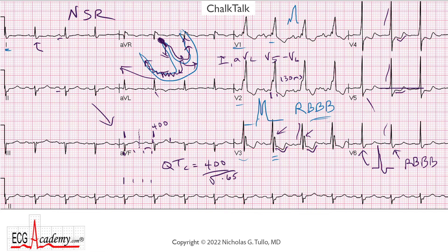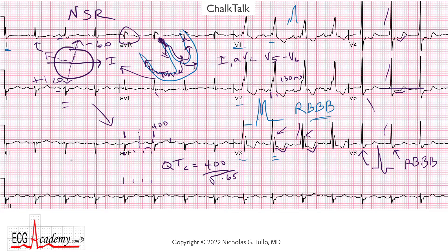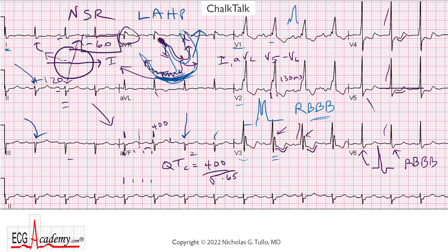Next thing to look at is the axis. Look for which lead is most isoelectric — it looks like it's AVR. AVR should never be isoelectric under normal circumstances because AVR is pointed about 30 degrees above lead 1 headed towards the right arm. That means the axis is either minus 60 or plus 120. If you look at leads 2, 3, and AVF, they're negative — meaning the axis is going away from the feet — so minus 60 is the correct axis. The first thing you want to do is make sure you're not dealing with an old inferior MI, because if you have an old inferior MI and the underside of the heart is not working, the axis will tend to shift upwards towards the left. But we do not have Q waves in the inferior leads — leads 2, 3, and AVF have little tiny R waves, and there's a clear R wave in lead 2. So it's not an old inferior MI, and therefore it must be left anterior hemiblock, or left anterior fascicular block.